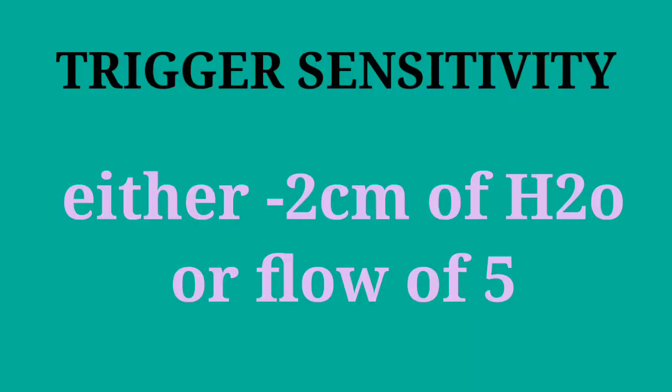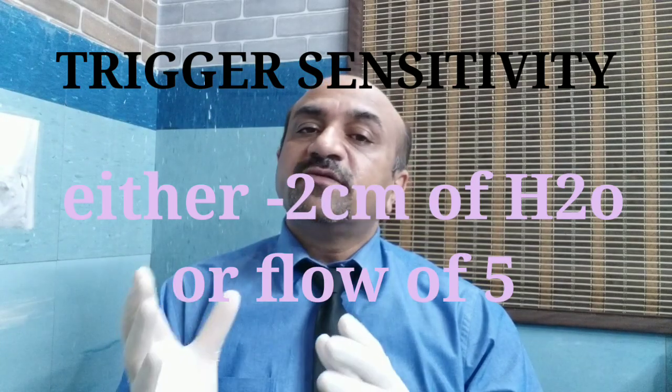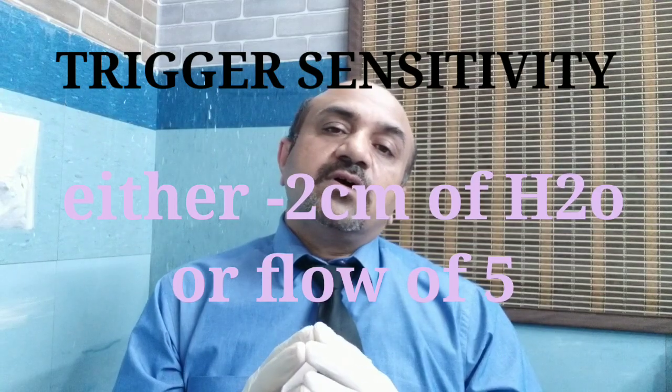And the last and very important thing: we are to set the trigger sensitivity of the ventilator. It may be -2 centimeter of pressure, or 5 liter per minute flow. So whenever the patient is in need of an additional breath, the patient can just trigger the vent, and the ventilator will give an additional breath of the tidal volume which we have set on the ventilator.